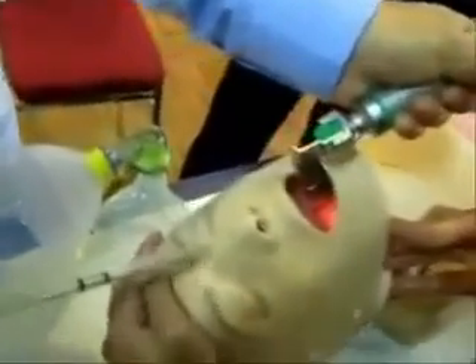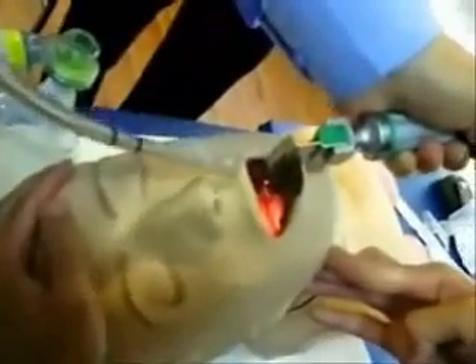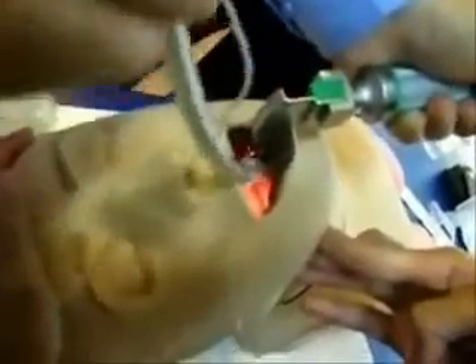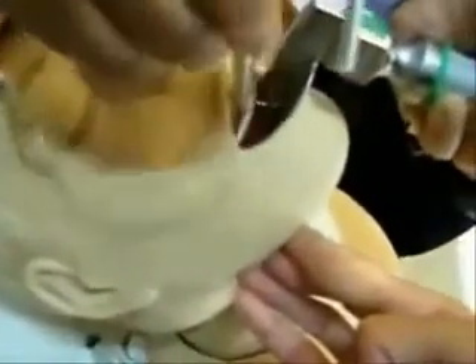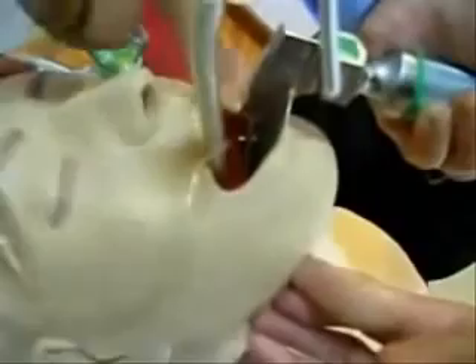Maintaining the forward and upward thrust, and now you can insert the endotracheal tube into the laryngeal opening. The tube can be inserted up to the mark 19 or 20, which is labeled here on the endotracheal tube.